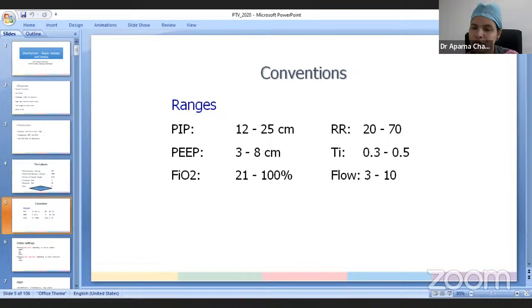Respiratory rate will be close to the natural frequency of the baby. Of course, when we are ventilating the baby for apnea, we also should not take over the ventilation. We should not be doing overdrive ventilation. So we keep the respiratory rate slightly lower than the natural frequency. So you may begin with 25 or 30 breaths per minute for a term baby, or 30 to 40 breaths for a preterm baby, in order to encourage the baby also to spontaneously breathe.